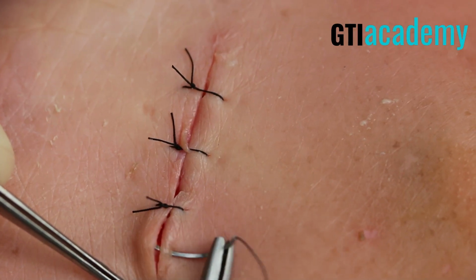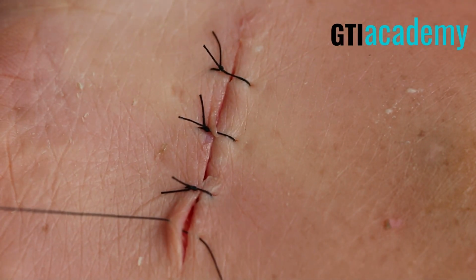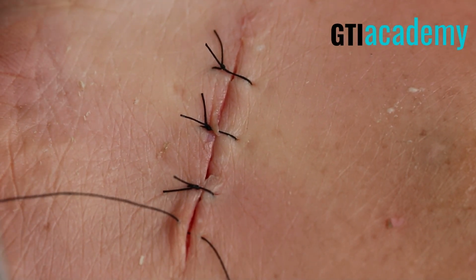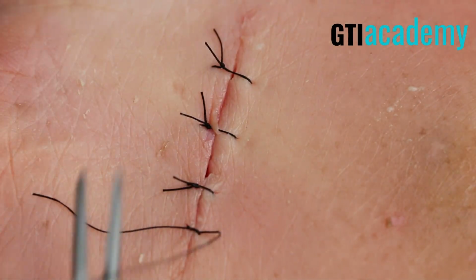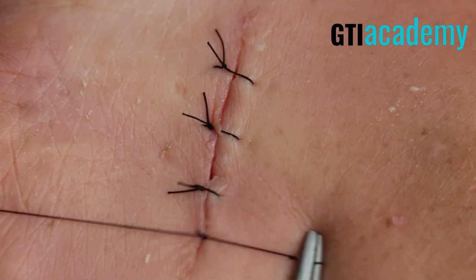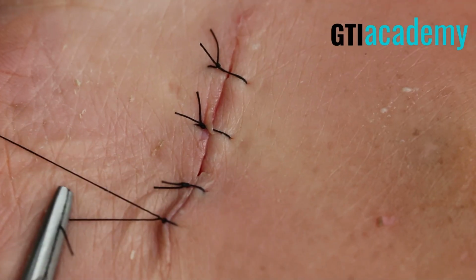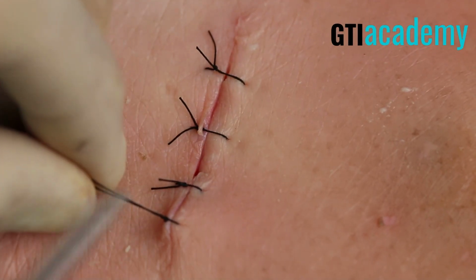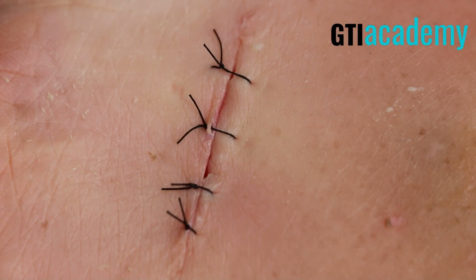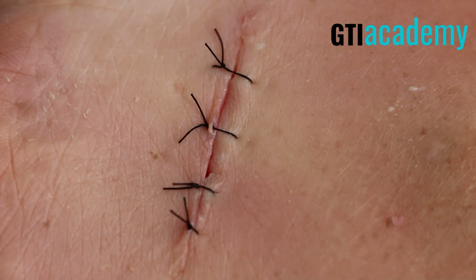Measure this suture to the end of the wound. Take half the distance. Right now I'm using 2-0 silk. It's a really popular suture. I'm actually using a larger needle here so you can see. I really would prefer a little smaller needle and maybe a suture of 3-0 in this small wound. But for demonstration purposes, this needle will suffice. Notice equidistance, equal length on those free ends of the suture.